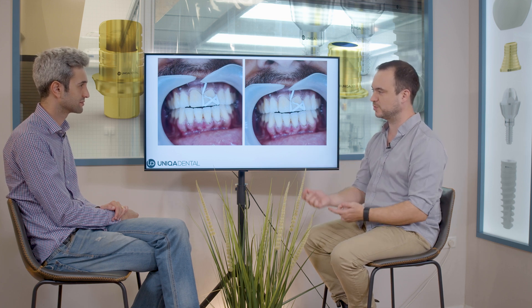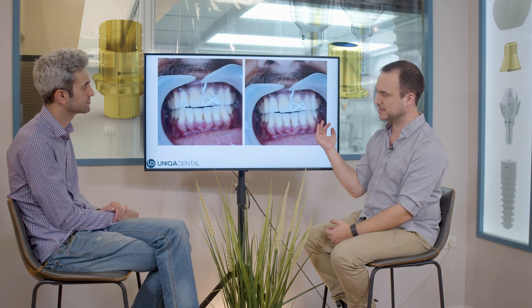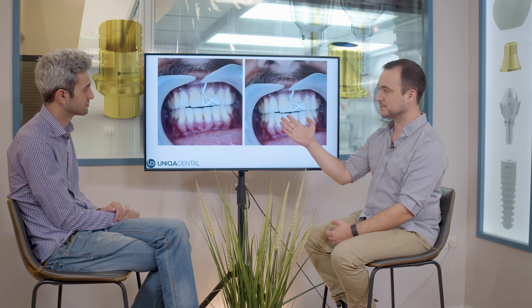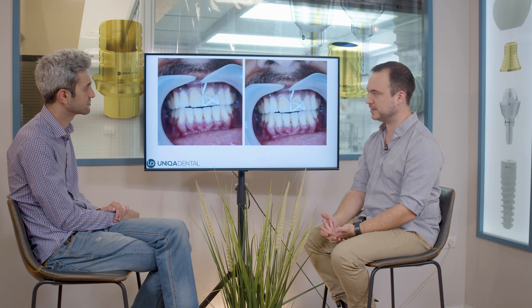You can clean quite easily because you already have floss between the crowns and the gingiva. You just move it from one side to another, cleaning each tooth. And you can see also that the color of the crown is very similar to his own teeth.